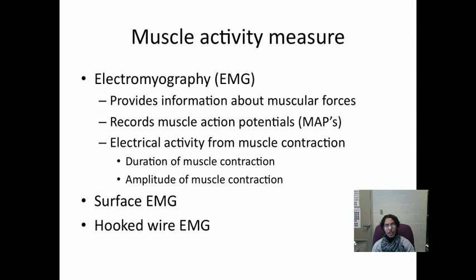A lot of this has been done in the physical therapy literature, and people have used information from the physical therapy literature and applied it. I would say most of the studies have been done with the muscles of the mouth, at the level of the lip and the tongue, where they've done some of the EMG activities.